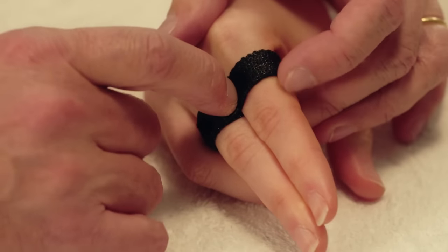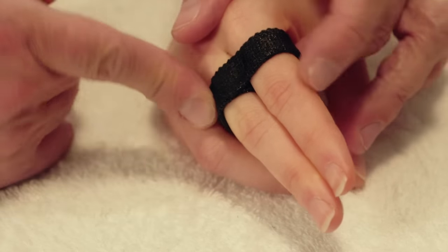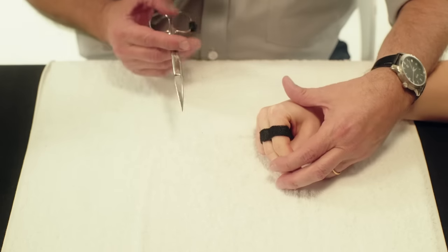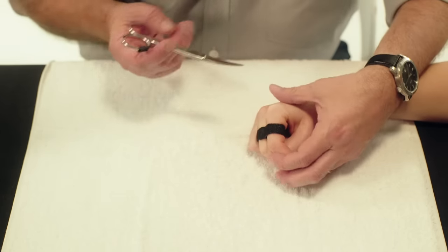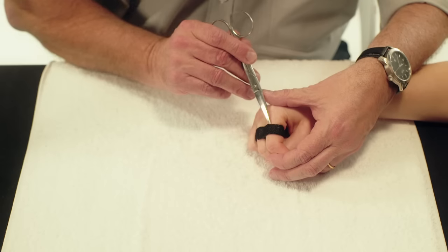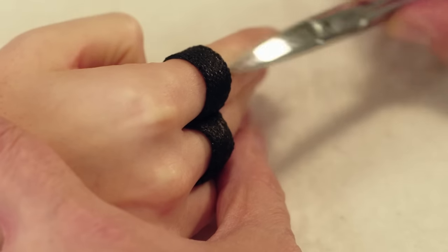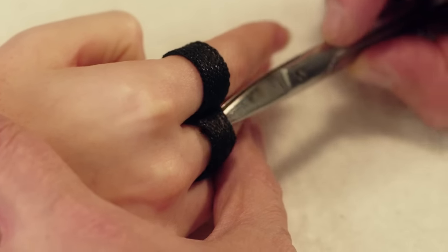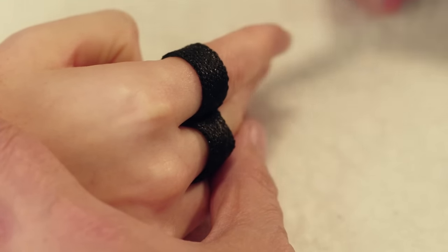Connect by applying sufficient pressure. Place the fingers in a slightly flexed posture and maintain the orthosis in place. Enlarge the finger holes by running a curved scissor inside the edges. Cut any excess material.